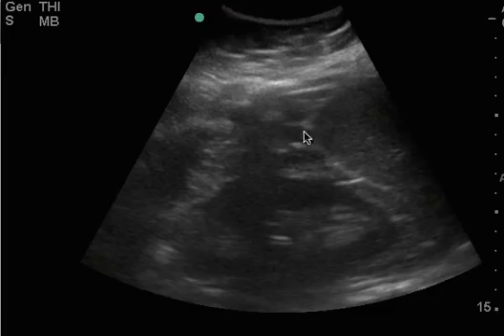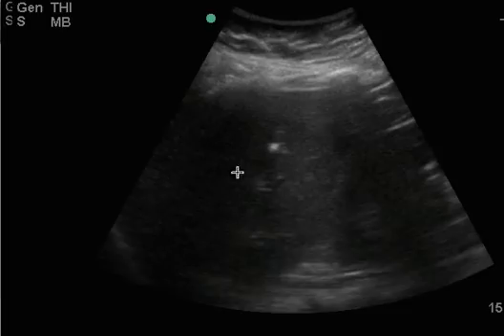This is backwards. The way you want it, and you have this later on, but on the right side, this is the liver and the kidney. See how it's opposite, where you have the liver here and the kidney. And so clearly you can tell on this image that this is the correct one.